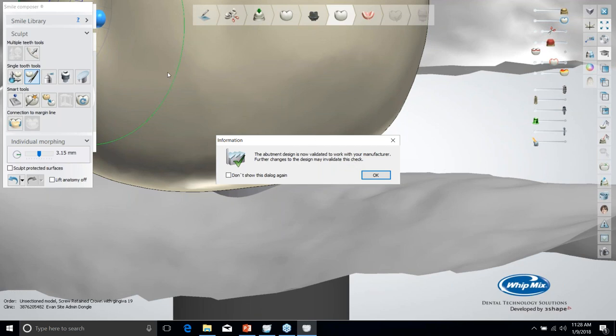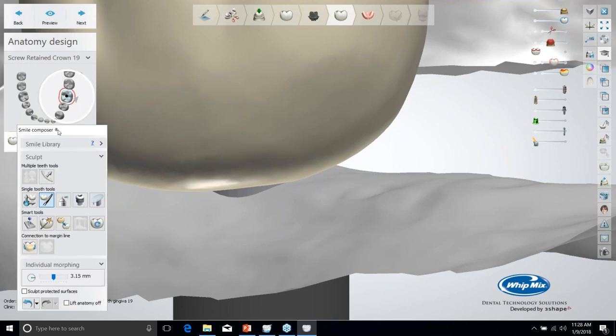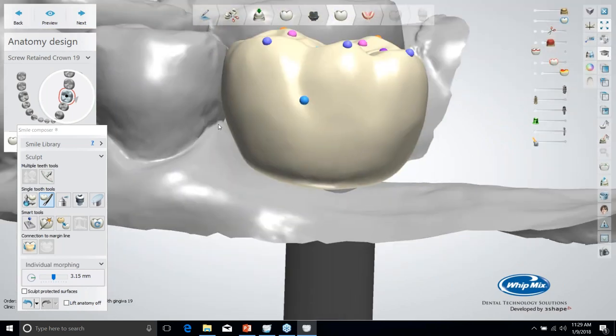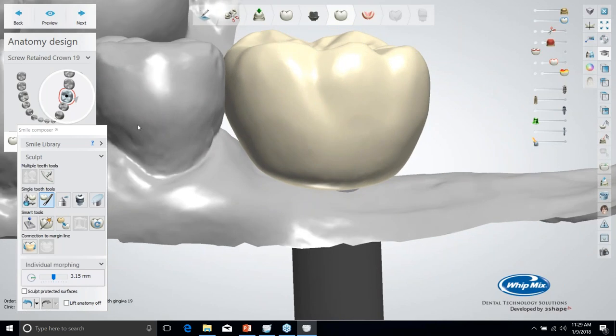During each stage, it's going to check your design based on settings in the control panel that the manufacturer set up, like minimum thickness from the tie base, minimum or maximum margin height or distance from the implant on the margin. And if you are doing a solid titanium abutment that's milled out of a blank, it'll be checking to make sure your design is within a blank. If you violate any of the manufacturer's settings, then it will not let you move on with that abutment, or at the very end, it's not going to save it and let you output it.